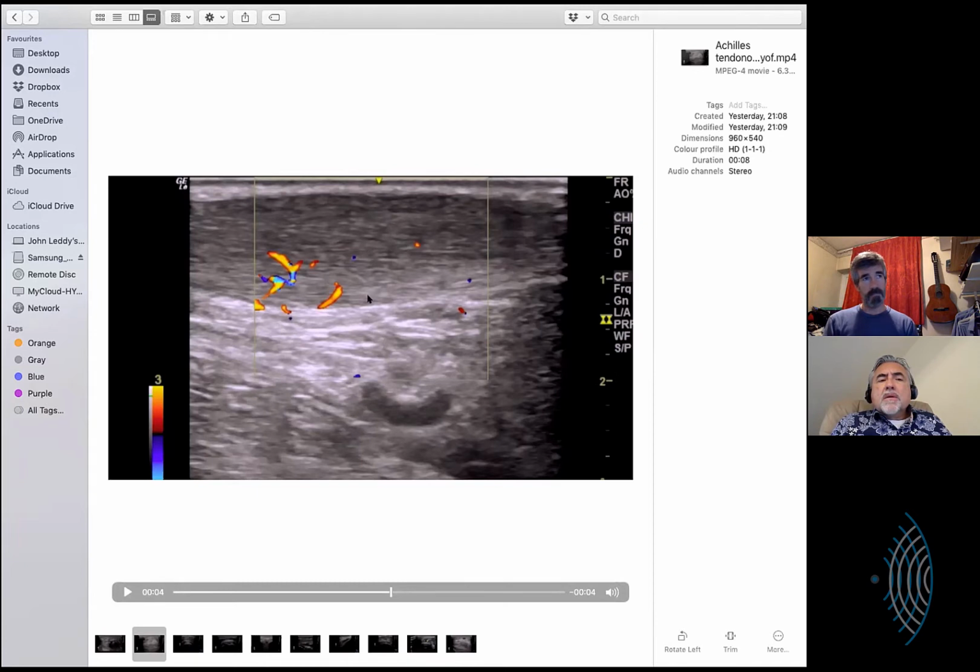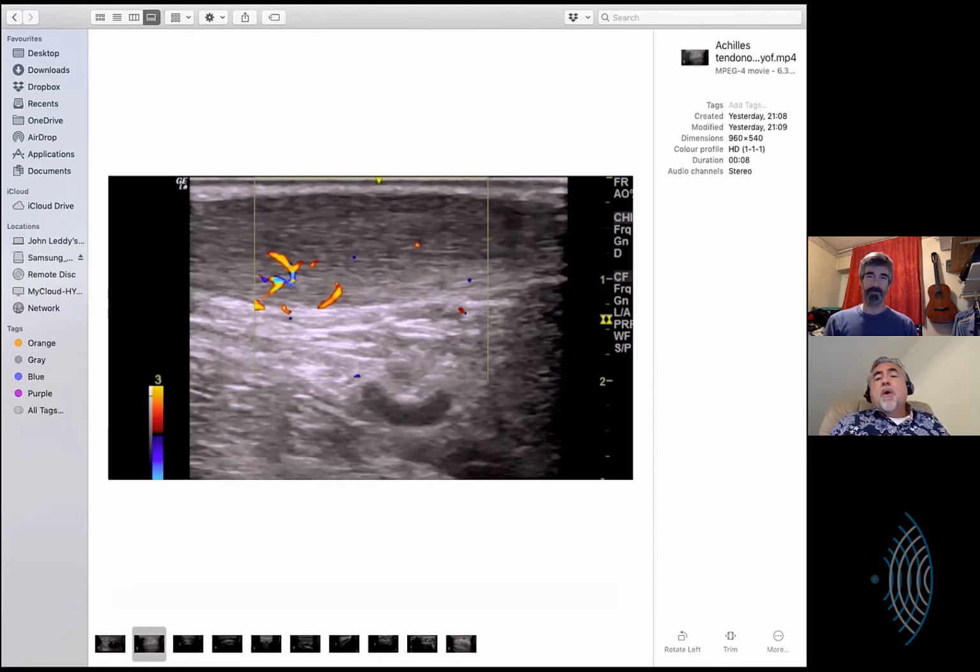And this was relatively mild. This is in a nearly 90-year-old female. This is quite thick. That's where I wanted to go next. You brought up the grayscale that doesn't seem to change, but you could actually see that the color flow does change based on whether they're having an acute flare or a recent aggravation, or that they're in a down phase.